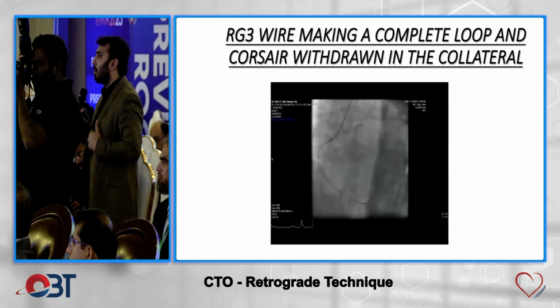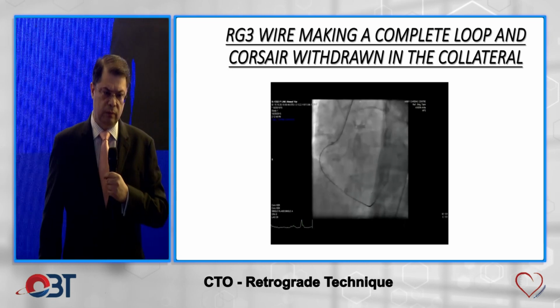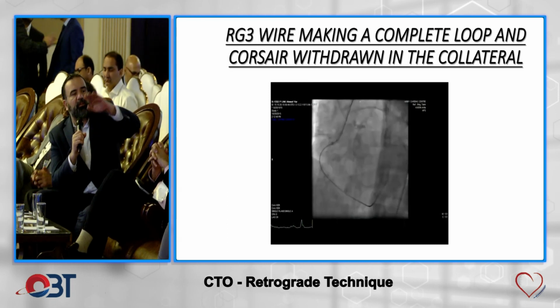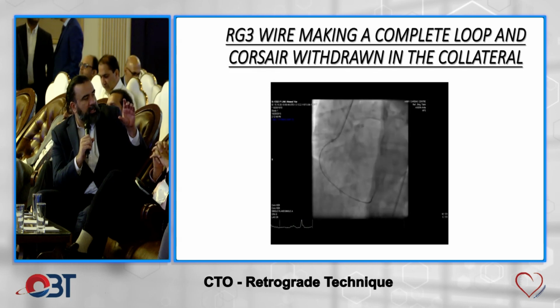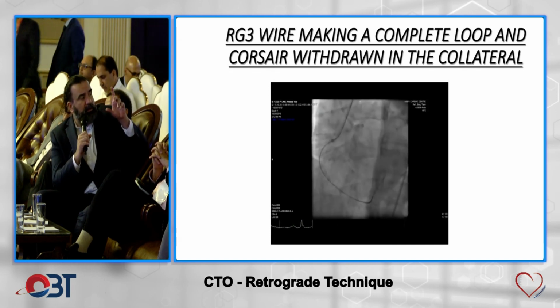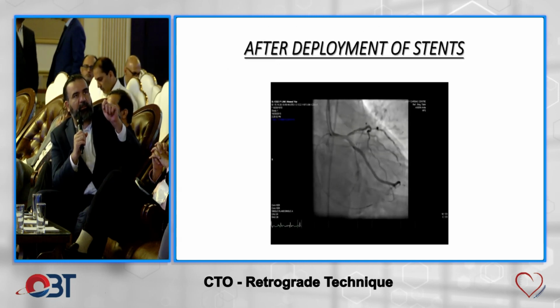Okay, the first question is why couldn't you get into the guide: because the left main is very wide, and whatever guide is sitting is sitting at an angle, so the wire comes off to one side and the guide is on the other, so it's very hard to get into that channel. That is why they used a guide extender, but sometimes even then the left main is too wide. The cheese cutting effect happens if you pull the wire across an angle, right?